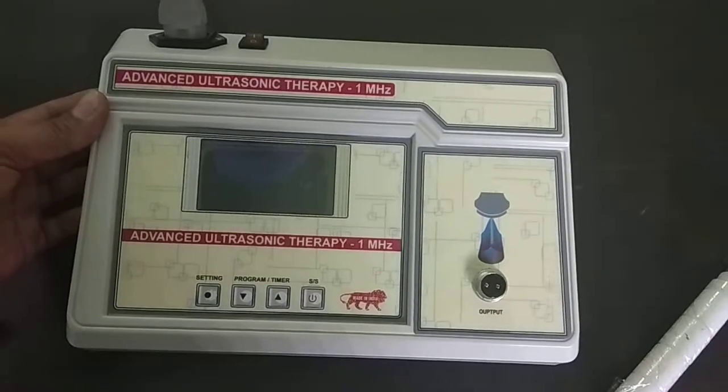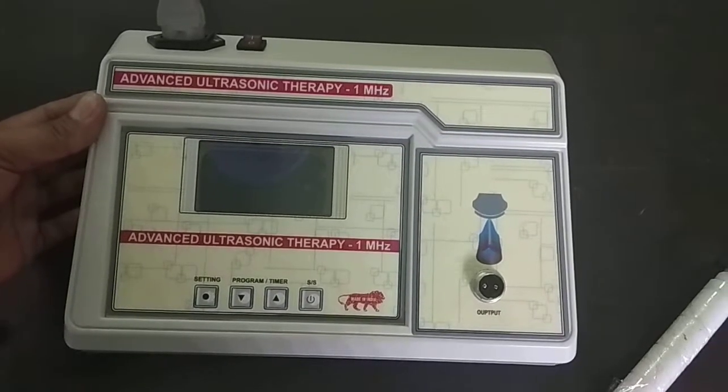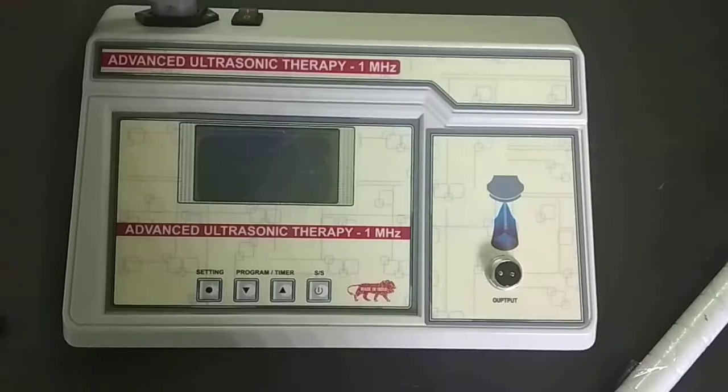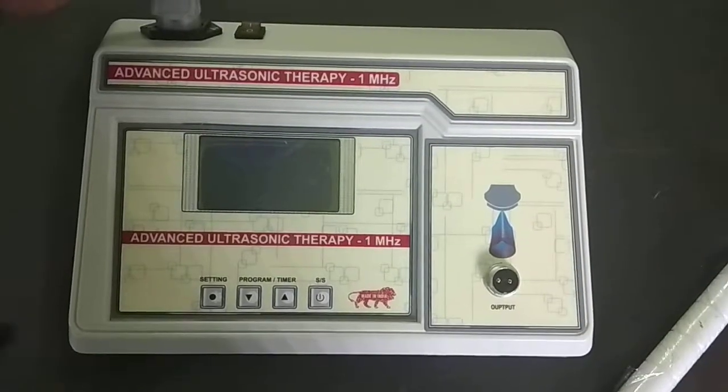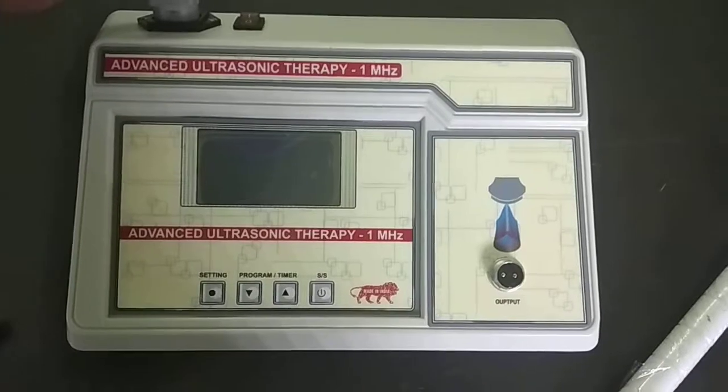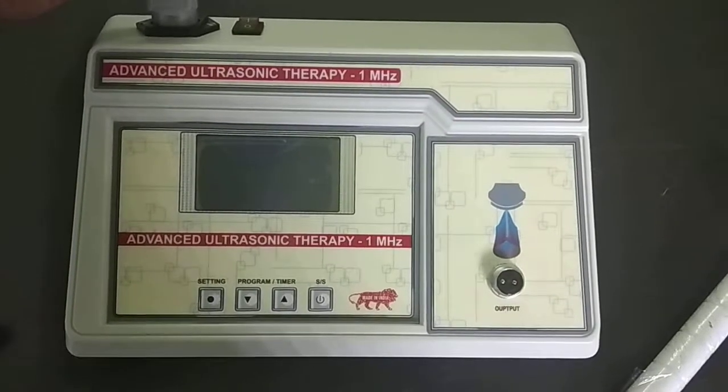This is 1MHz Advanced Ultrasonic Therapy with Graphical LCD and 55 programs.